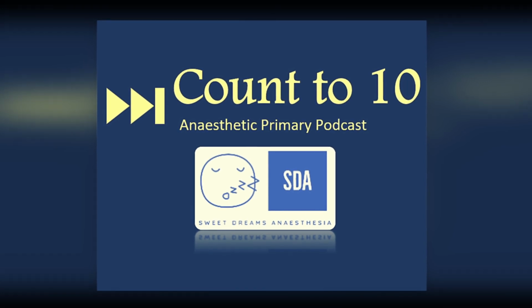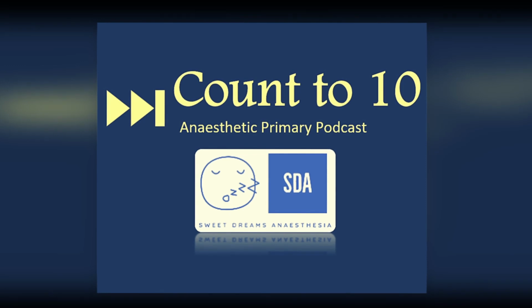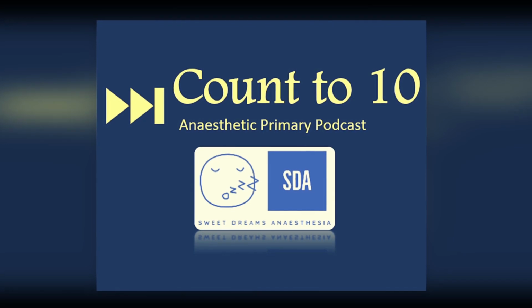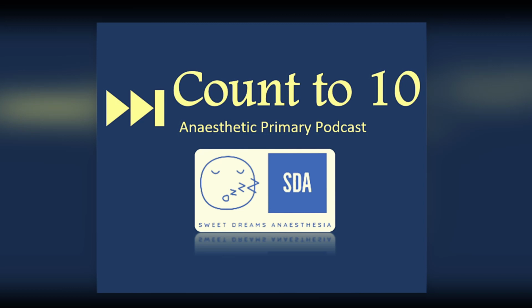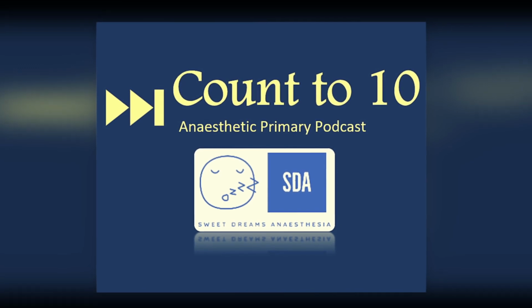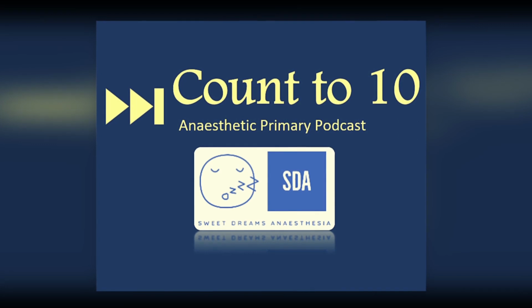At the central processor, the biggest error with the pulse oximeter relates back to how the data was extrapolated. Because you couldn't give healthy subjects hypoxic mixtures below 75% saturation, the pulse oximeter reading becomes increasingly unreliable. Between 70 to 100%, they say there's an error of plus or minus 2 to 3%. Between 50 to 70%, they say there's an error plus or minus 3 to 4%. And below 50%, any value is unreliable.